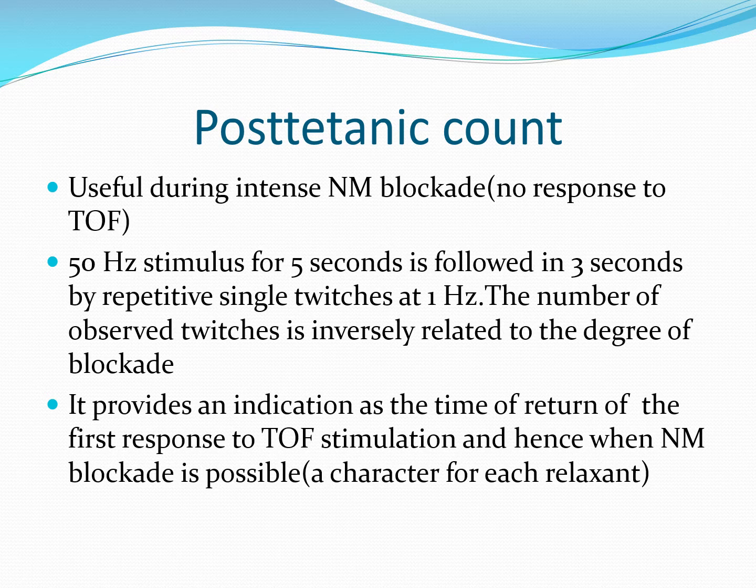Post-tetanic count. This is very useful during intense neuromuscular blockade, in which there is no response to train of four. A 50 Hertz stimulus for 5 seconds is followed in 3 seconds by repeated single twitches at 1 Hertz, and the number of observed twitches is inversely related to the degree of blockade.